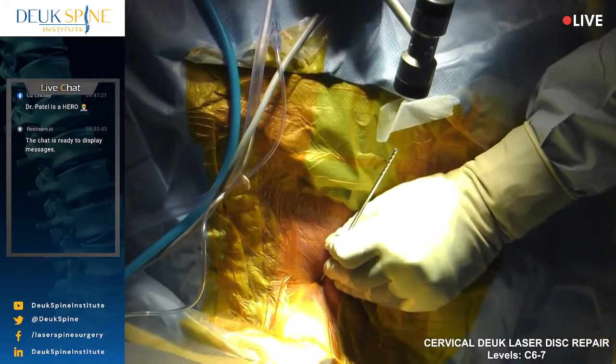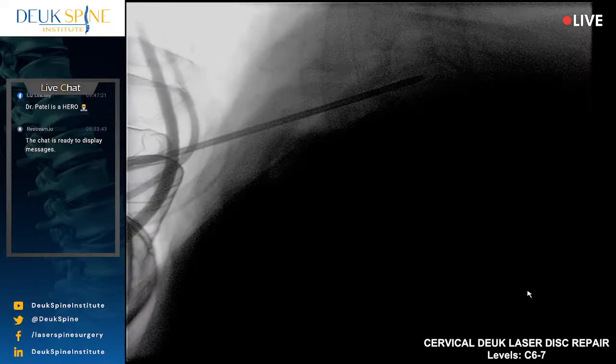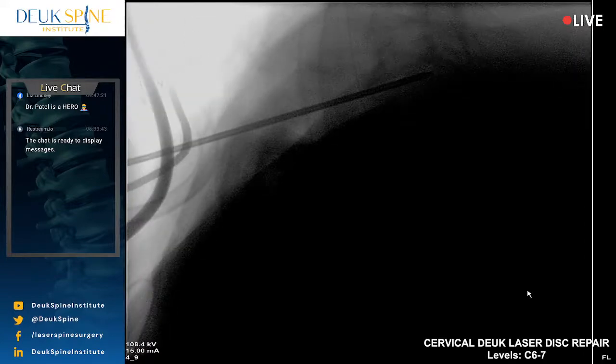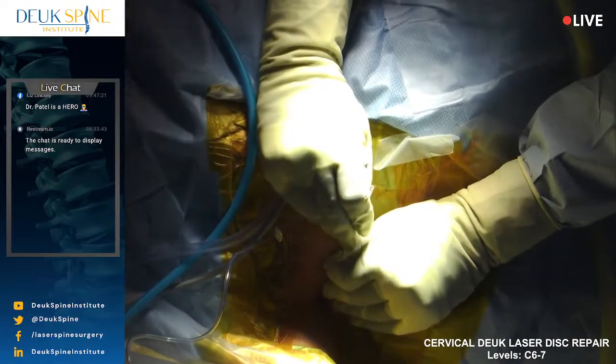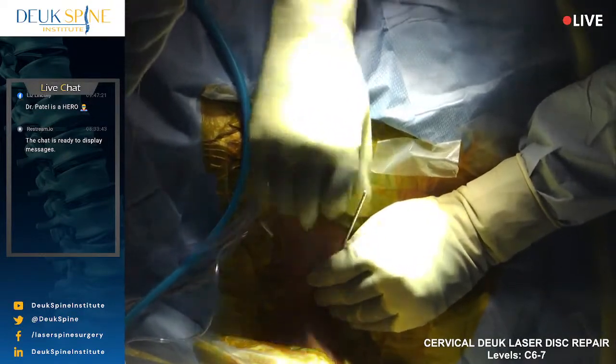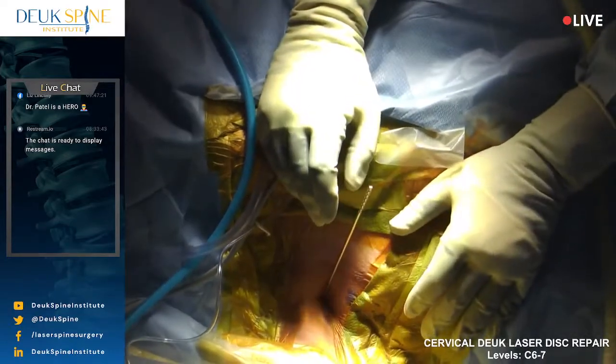C6-7 is the hardest disc to get to, especially in people with big shoulders. We're pretty much there. I didn't get to do my discogram, so I'm going to pull it back just a little bit. I don't know if we'll get a discogram. We can try. Let's get some shoulder again.